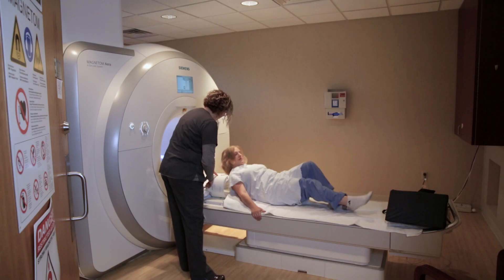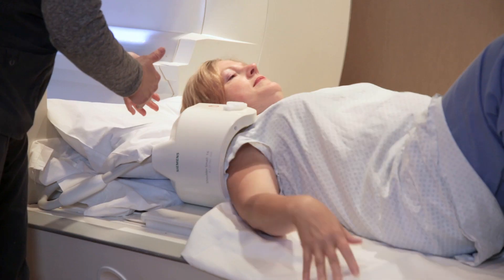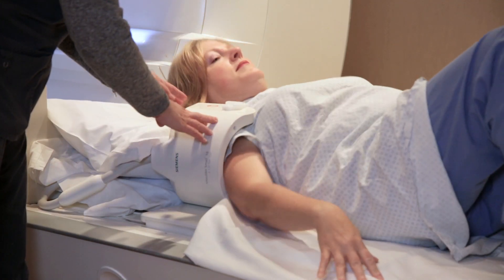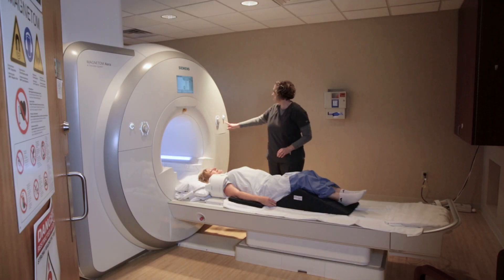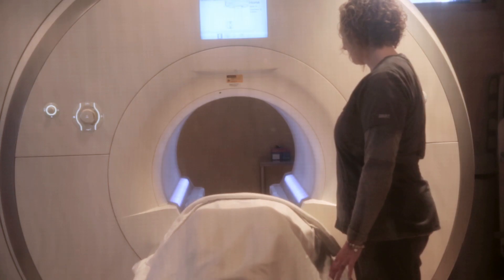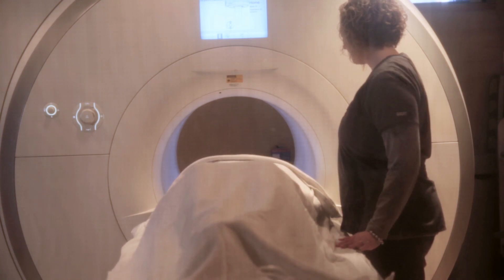When a patient at CDI has an MRI of the shoulder, they are going to be going into the scanner head first. We'll put a cushion under the knees to help make them comfortable. Their shoulder is going into a coil, and their arm is going to be positioned down along their side. Once we have them in position, we send them into the scanner and get the images that we need.